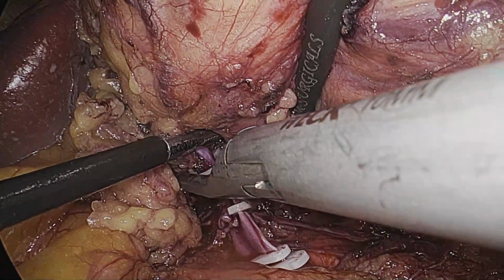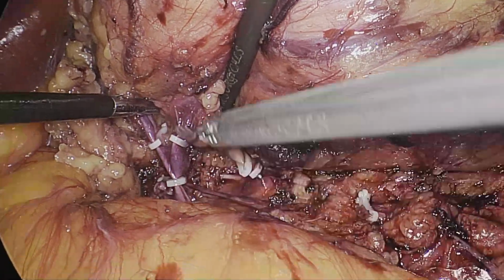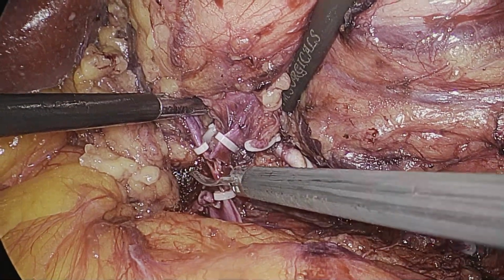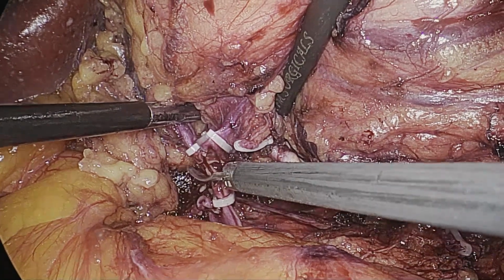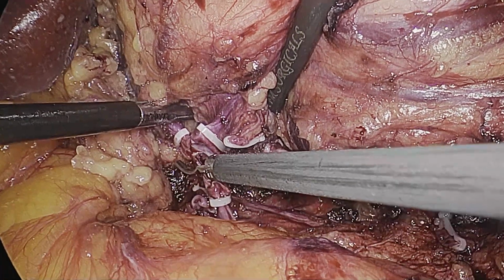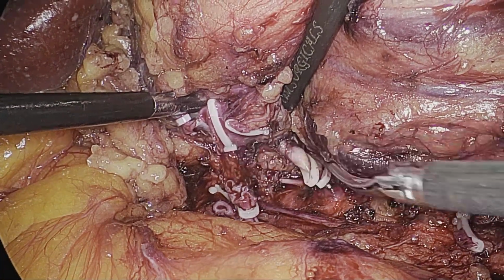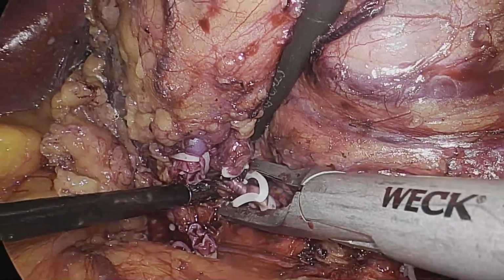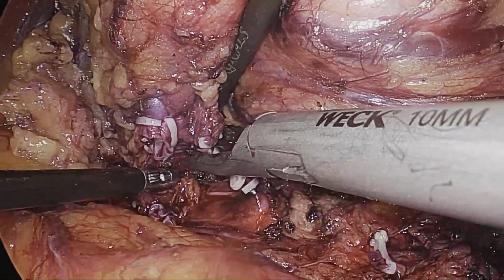So here we are applying two separate clips on these branched renal veins, and the renal vein will be cut in between. Another clip at the renal artery towards the specimen side, and it will be cut in between.